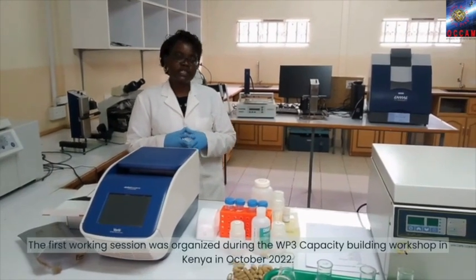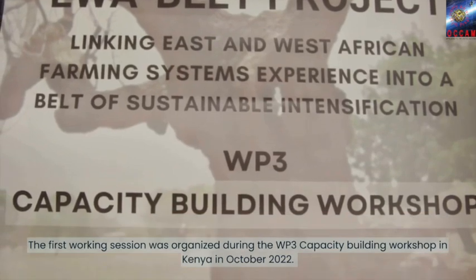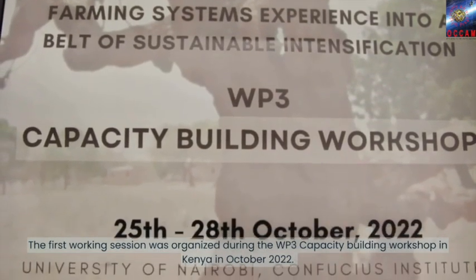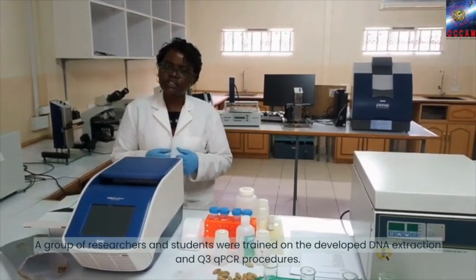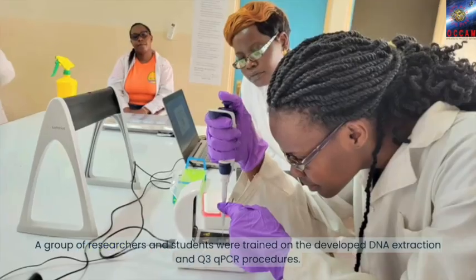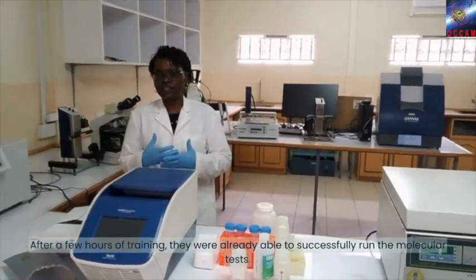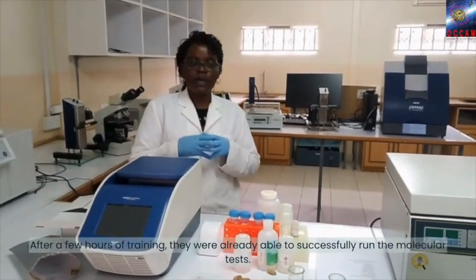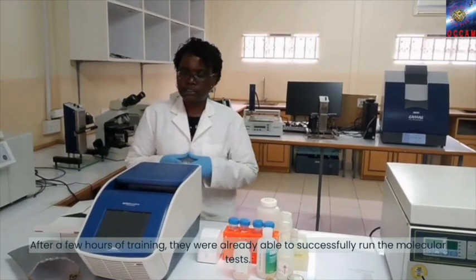The first working session was organized during the WP3 capacity building workshop in Kenya in October 2022. A group of researchers and students were trained on the developed DNA extraction and qPCR procedures. After a few hours of training, they were already able to successfully run the molecular tests.